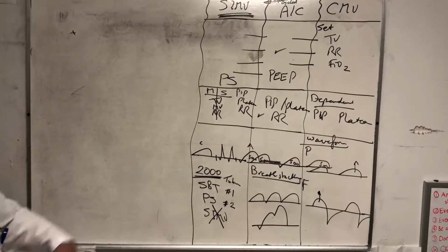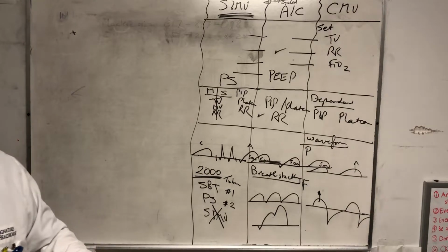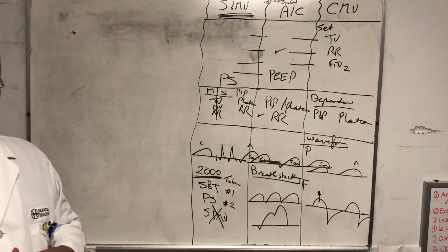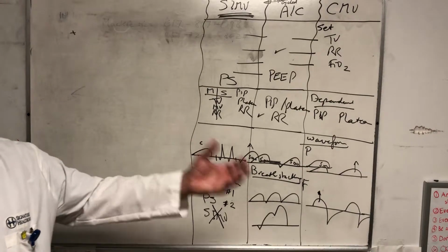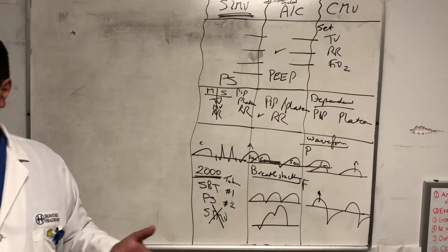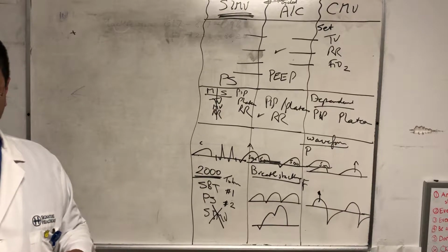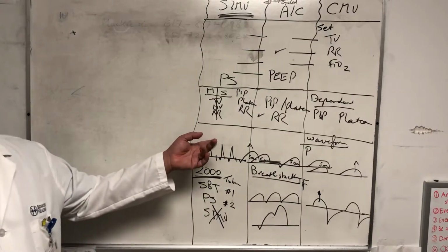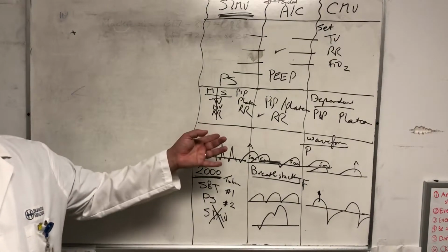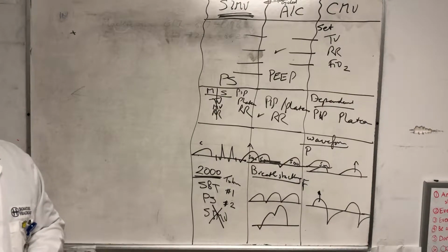So as I told you before, there was a barrage of dependent parameters that came at the intensivist. They had to organize it in a way, because I would look at the respiratory rate, and everybody would look at something else to wean the patient. So they had to come up with some weaning guidelines and parameters. The whole weaning protocols came from this era, and I think it's because of the SIMV, right? So multiple ways were developed.